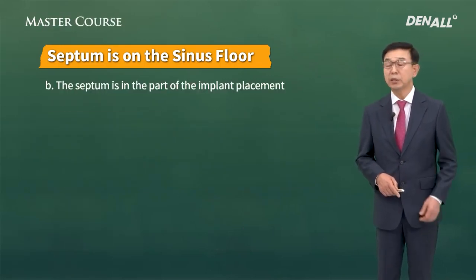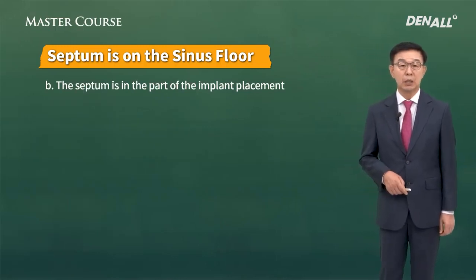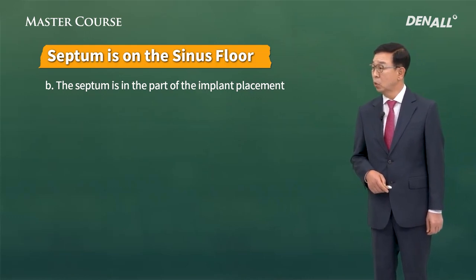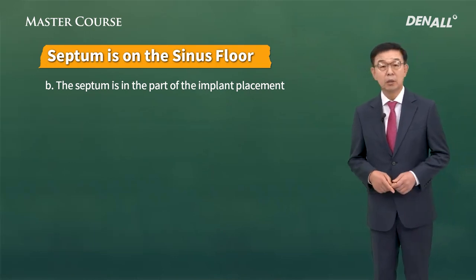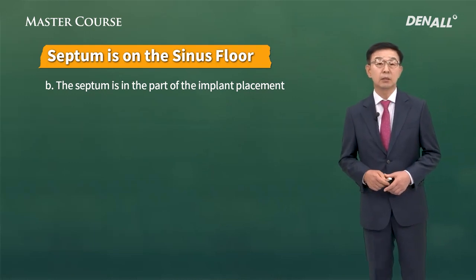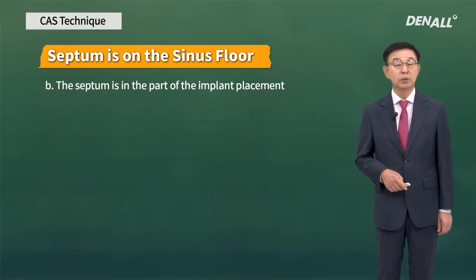At times, the septum can be in the implant placement position. In general, the method using osteotome becomes very difficult. Because malleting is done, the patient can be traumatized. If you use the CAS kit appropriately, you can do crestal approach without causing trauma.